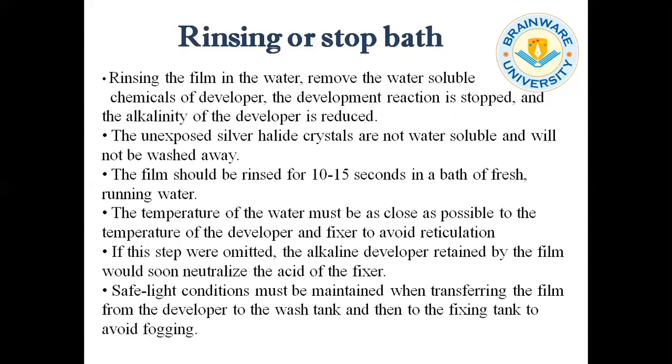And this procedure of taking the film out from the developer and putting it into the stop bath should be under the safe light, to avoid again illumination related fog.